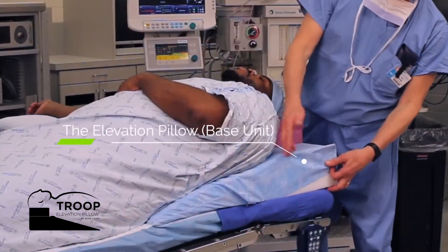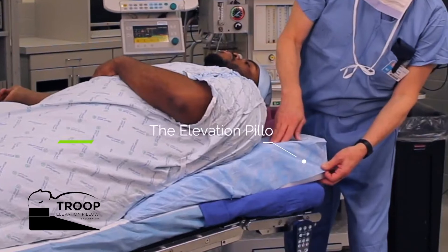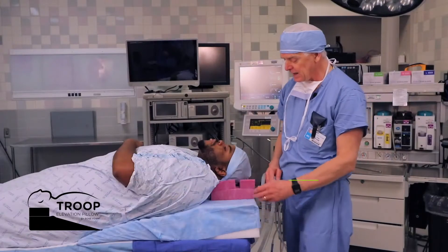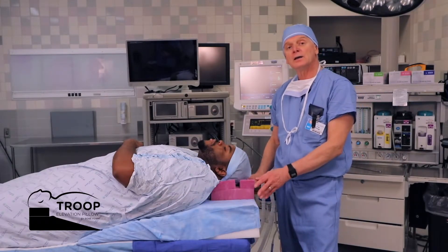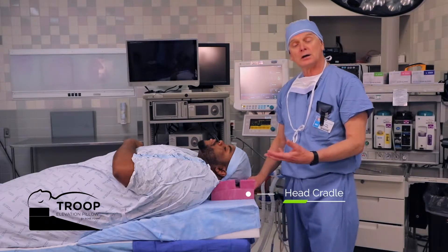The Elevation Pillow is a very specialized piece of sculptured foam. There's a little roll here, which is where the shoulders of the patient are to lie. It's designed to be used with any standard intubating pillow, standard headrest, or cradle.